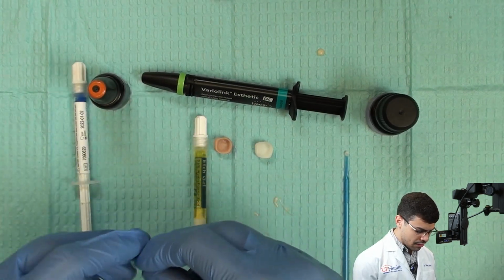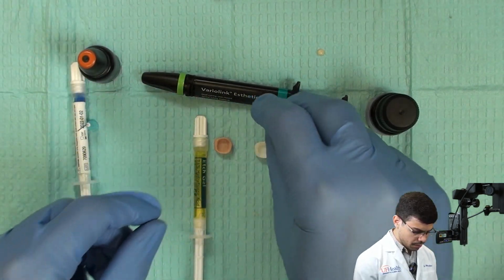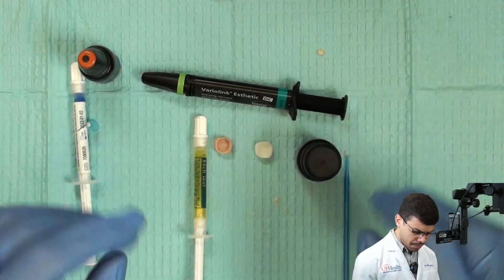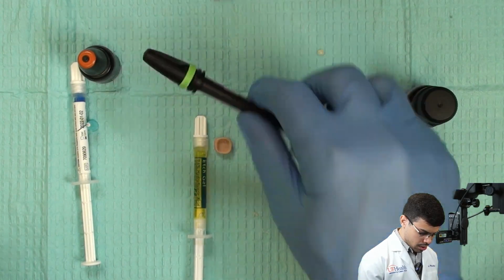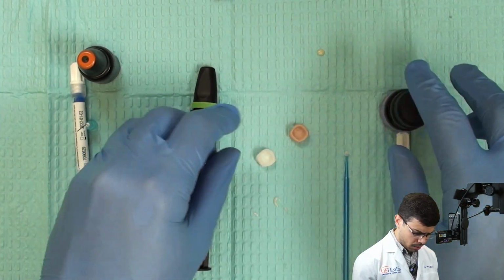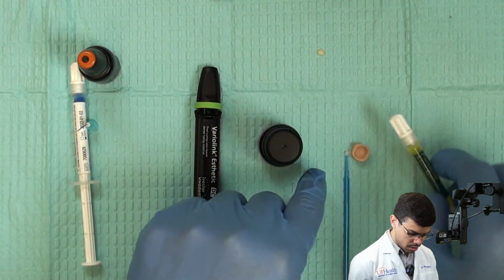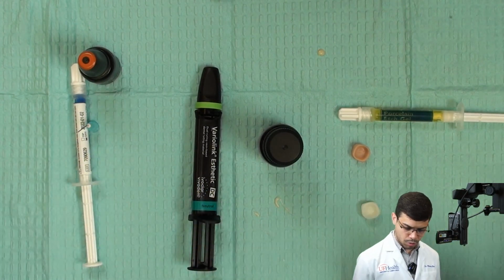Okay, so now I have everything set here. I have my adhesive system, I have my ceramic etching and priming depending on what I'm gonna do, and I have my cement. If you think about it, this is the order in which these are gonna be working. So you have Monobond Plus for the ceramic, cement in the middle, and the other part on the tooth.